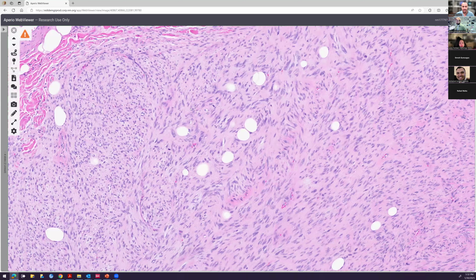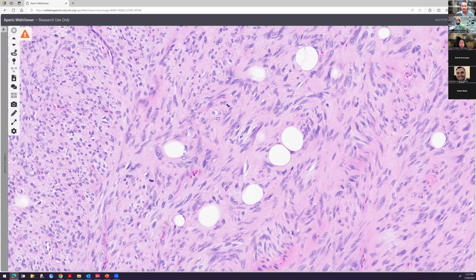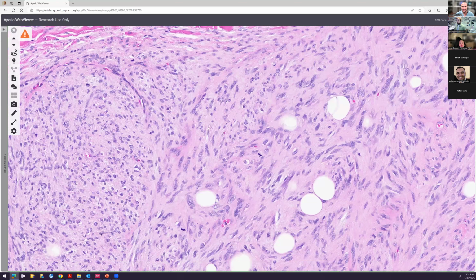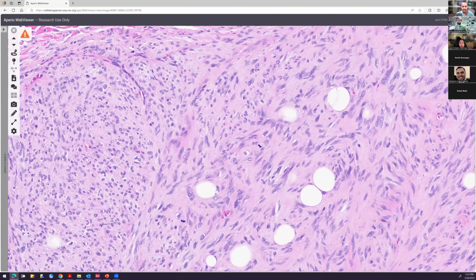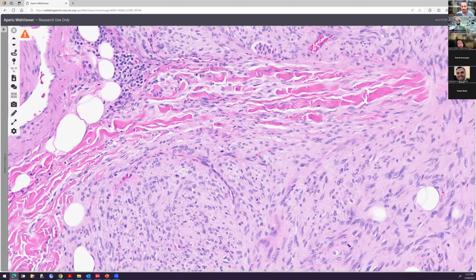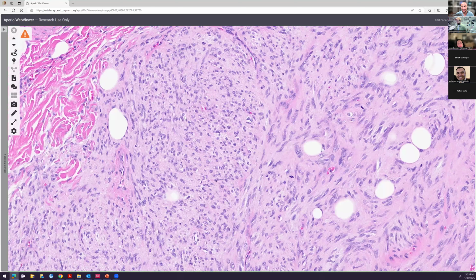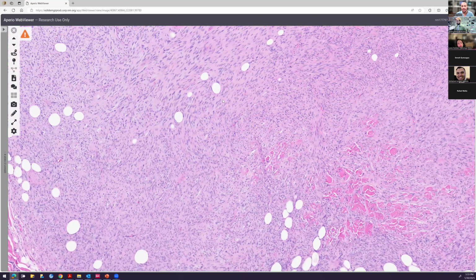It's a bit fascicular, but also generally fibrosarcomatous DFSP is going to have somewhere more than 4 to 5 mitotic figures per 10 high power fields, right? So usually, you're not really going to see fibrosarcomatous transformation in anything less than that generally. So that serves as a decent cutoff as well. So, we can actually see 1, 2, you know, 3 right here, maybe another one elsewhere. So there's several in this one. So this is enough generally here to call fibrosarcomatous transformation as well.